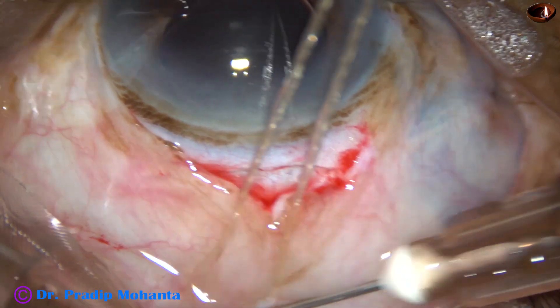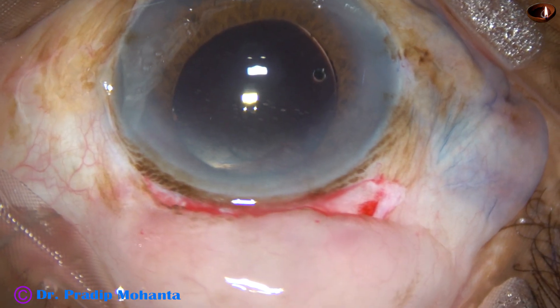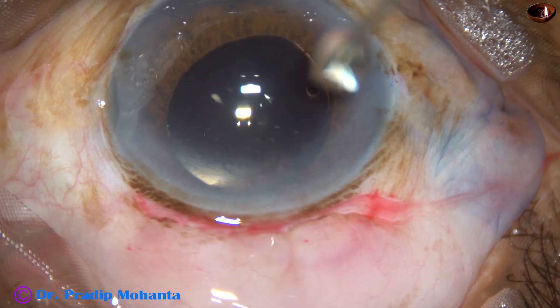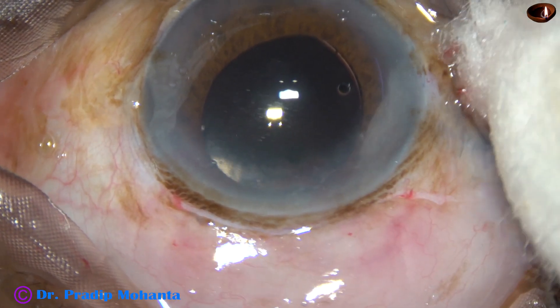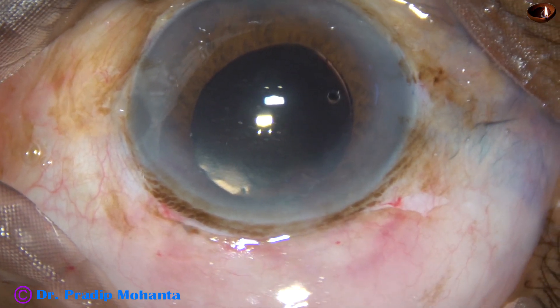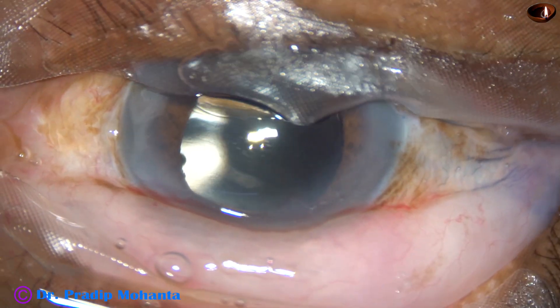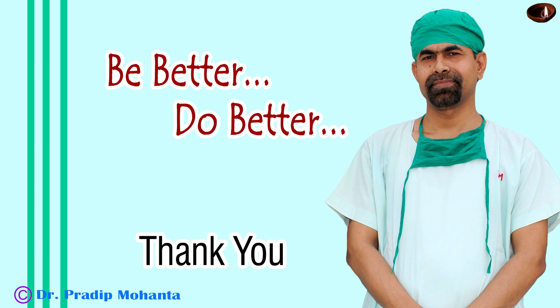Subconjunctival injection of dexamethasone and gentamicin is given superiorly. The bridle suture is removed, and the subconjunctival injection site is exposed to the limbus. As we remove the speculum, it will go further forward. No suture is required and no cautery is required. Thank you very much for your attention. Hope this video gives you very necessary tips and tricks to learn SICS and to do SICS in a very confident way. Be a great surgeon and serve mankind with love, respect, compassion, and great surgical skills.